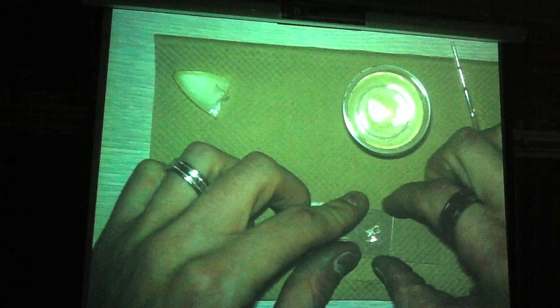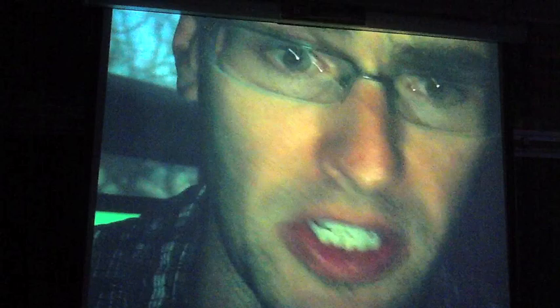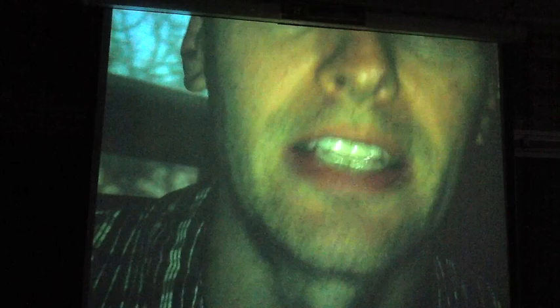Preparing cheek sample. You need a Q-tip, as you can see right here, and of course a willing participant to open up their mouth and rub the Q-tip to get a cheek cell sample. You need to do this twice, once for a water mount and once for a methylene blue stain mount. Open up your mouth and rub the Q-tip on the inside of your cheek. You may even want to get on top of your tongue, underneath the tongue, all around, to really soak it up with some good mucus, and then rub it on your slide to prepare your cheek cell sample.